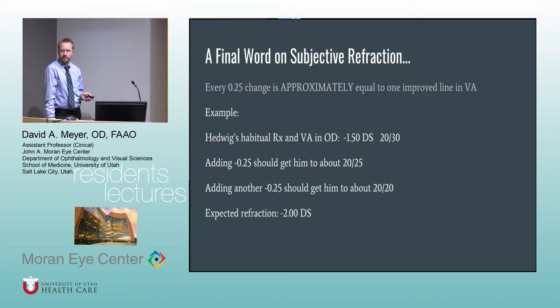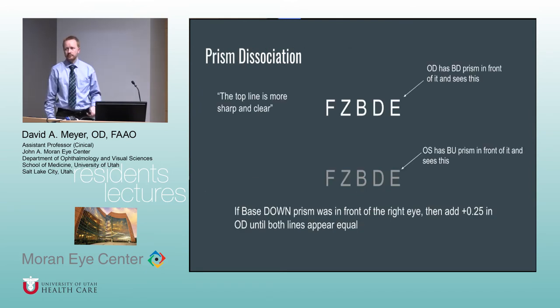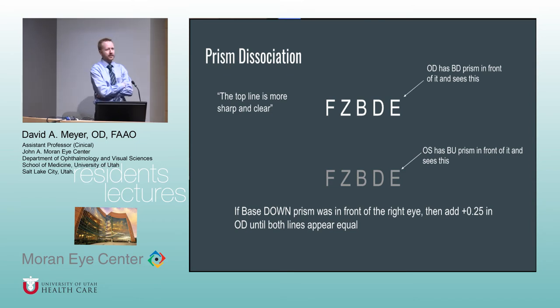One question about that. After you rebalance them, or you fog them and rebalance them, would you adjust your cylinder? I probably wouldn't. I'd probably keep whatever cylinder I had just the same. Yeah, because the cylinder axis and power should already be set by then. Okay, good question.